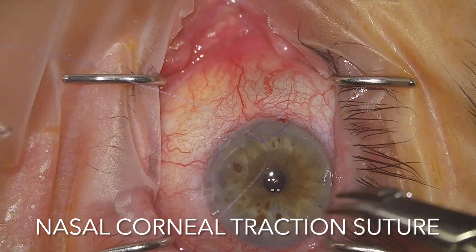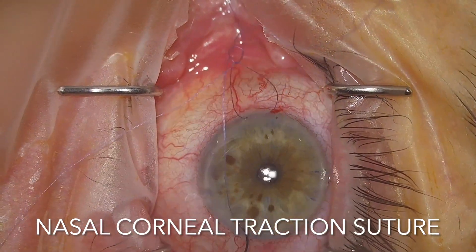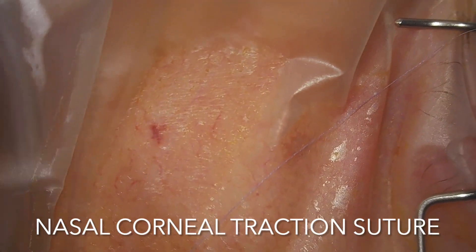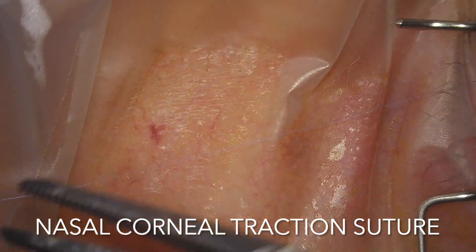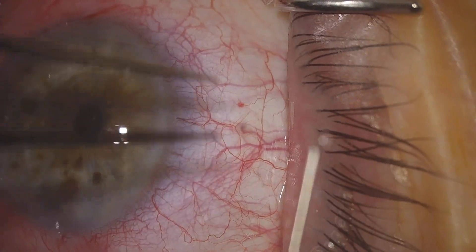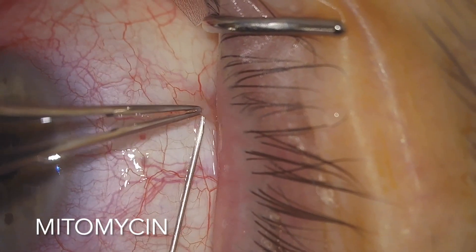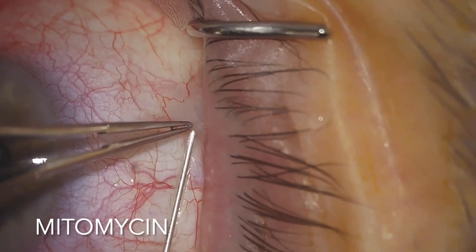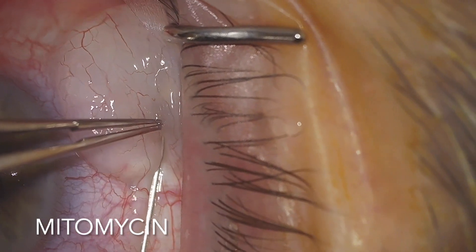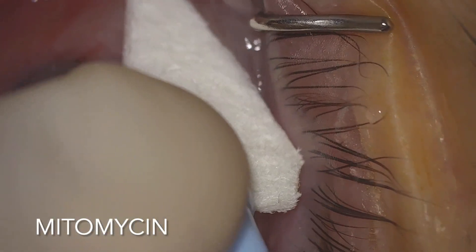I like this case because it can be completely suture-less — that's one reason. Right here we're just tying the traction suture off. I'm doing a Q knot to help stabilize the slippage of the suture, so that when I place the traction, if one of the two strands or threads of the suture don't slip at all, it'll still hold the other one — hence the Q knot.